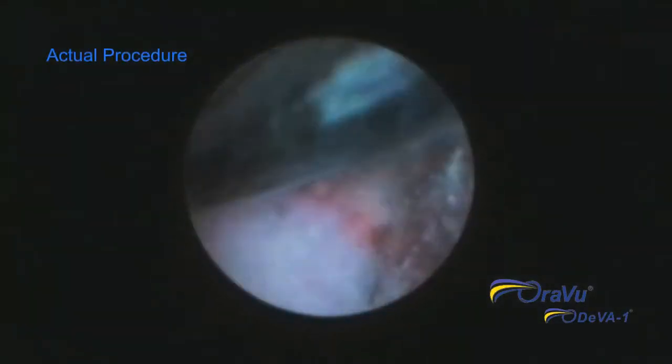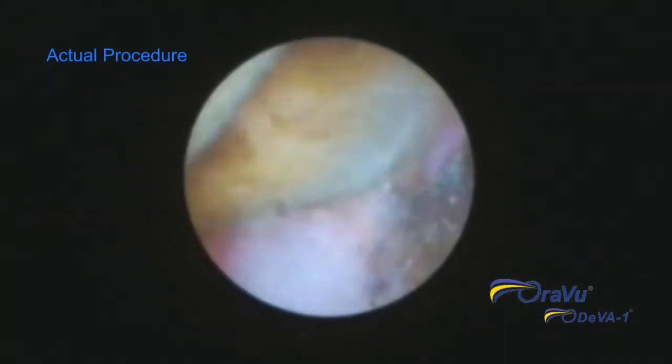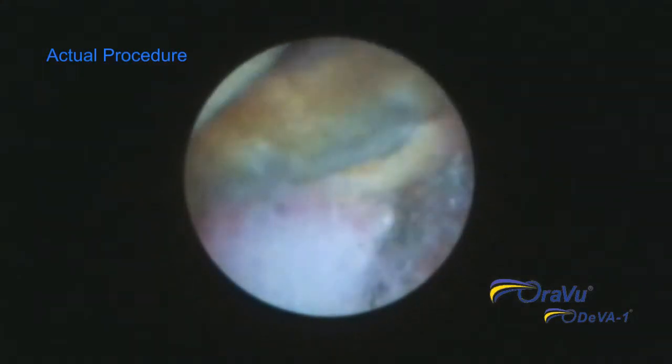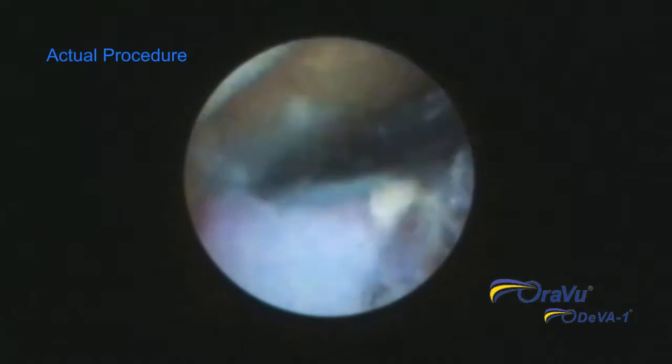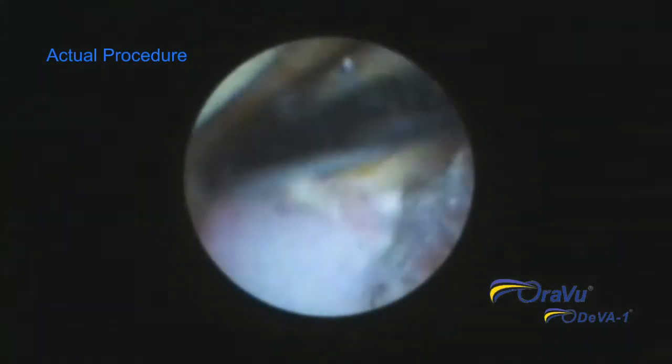This video was captured with the DIVA-1 system during a visual SRP procedure. You are seeing what the hygienist is seeing, which is a 3 millimeter diameter view inside the gingival pocket. The significant magnification causes some graininess. The DIVA-1 hand instrument is placed in one position at a time, shining light.